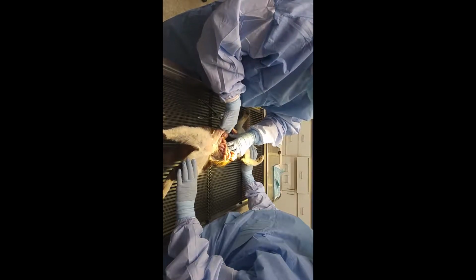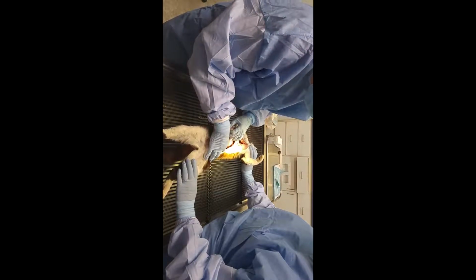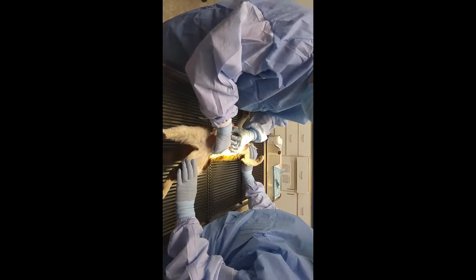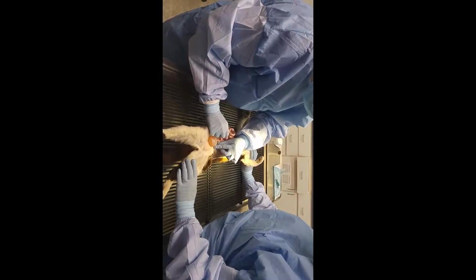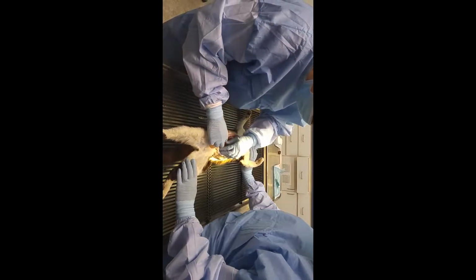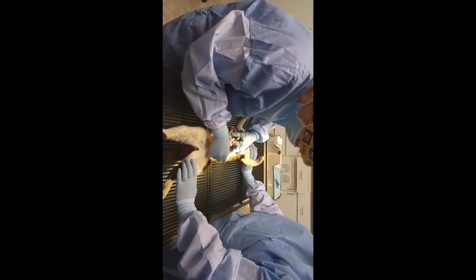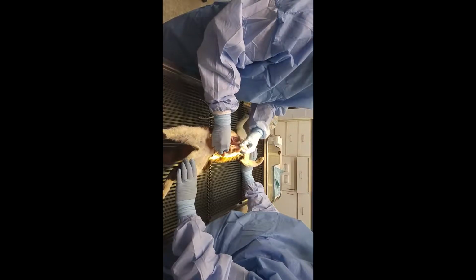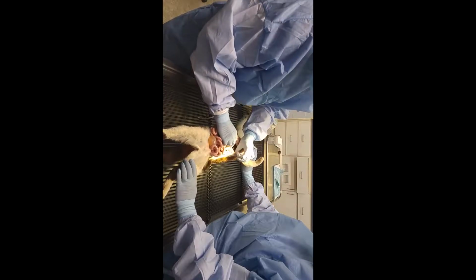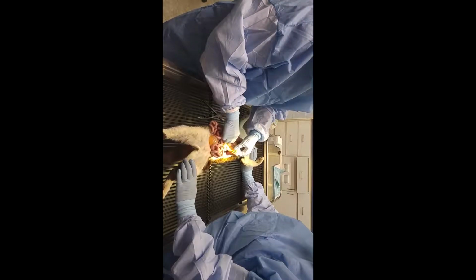We look down, we can definitely see her kidney there. Right kidney, left kidney. And her reproductive tract, which actually looks fairly small. She may have been experiencing a pseudo pregnancy, a false pregnancy. Intestinal loops definitely very, very thickened. And we'll go back and then take a look at the stomach and feel the contents there.